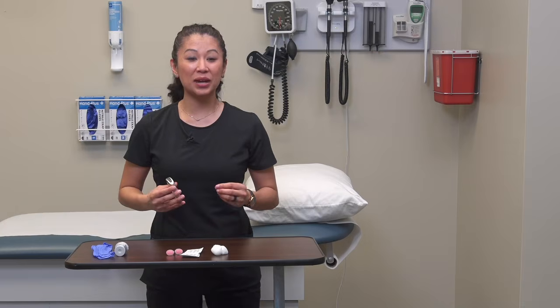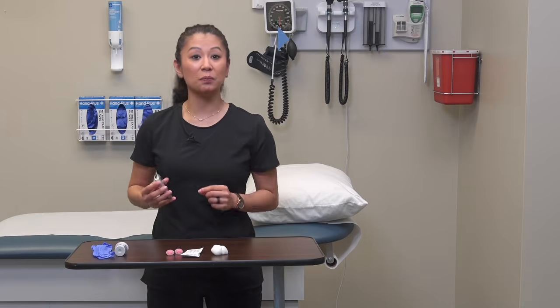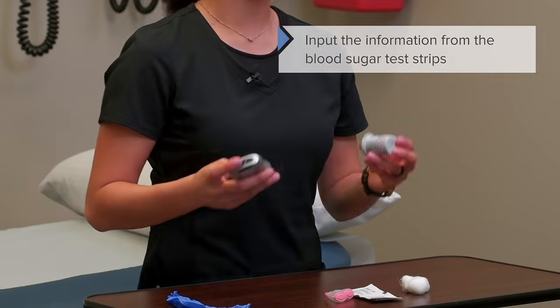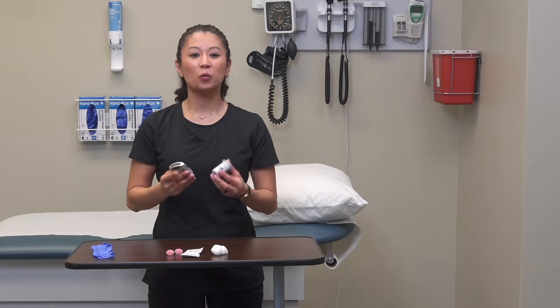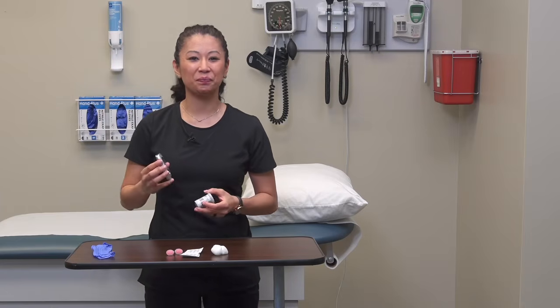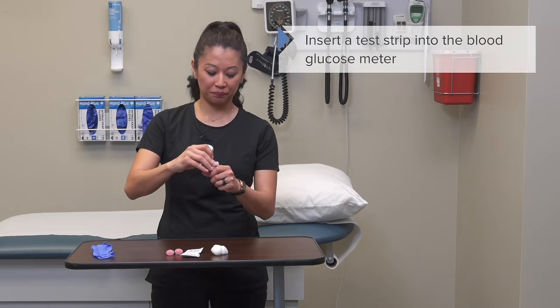Now, once we've made sure we have the right patient, we've got to identify the strips to the meter. So we're going to input that information as well. It would be by the same method: we would take our meter and scan our strips, the barcode here. We've got to make sure these test strips are recognized by our meter. Now, once we've done this, we can go ahead and insert the strip.